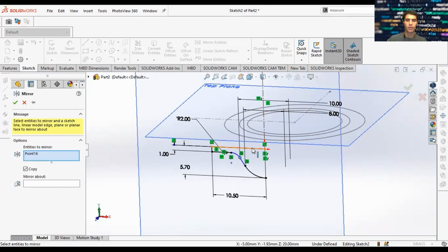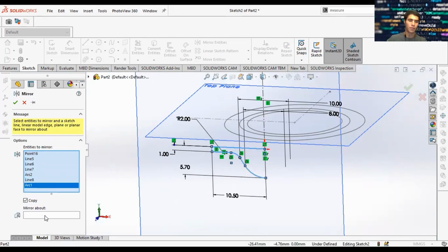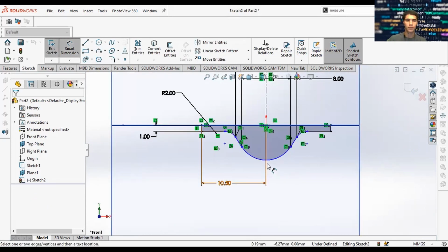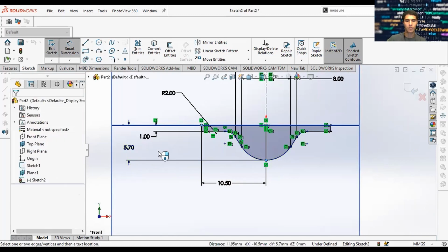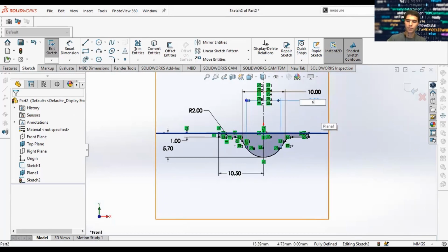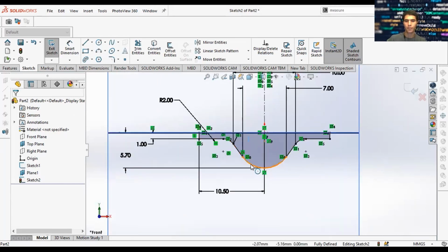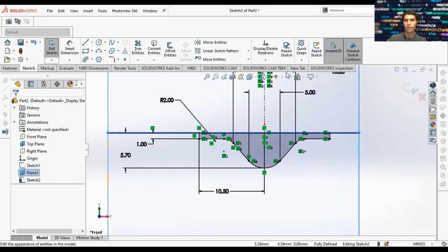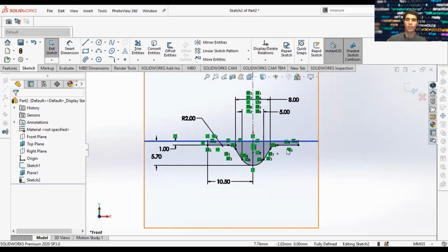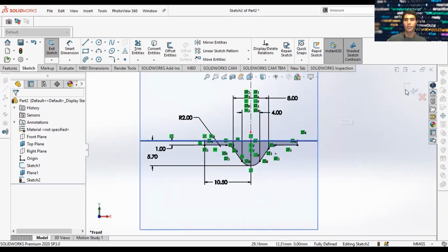So let's go ahead and mirror this, and mirror about this reference point. And let's finish the dimensions for the sketch to fully define it. And so now you have fully defined the sketch, you can control the parameters that you have within the sketch, which I think is easier. So now you can start getting more of that shape, like it is showing in the PowerPoint. So let's go ahead and go with this shape. That looks nice. All we have to do then is click D on our keyboard and approve it, or you can go up here to this icon and approve it there.